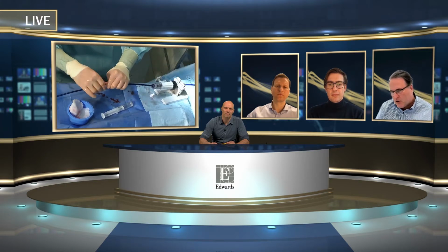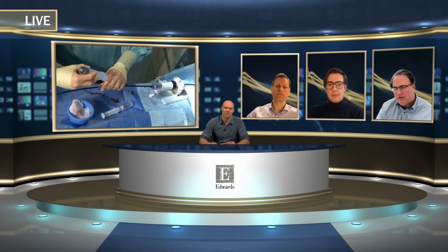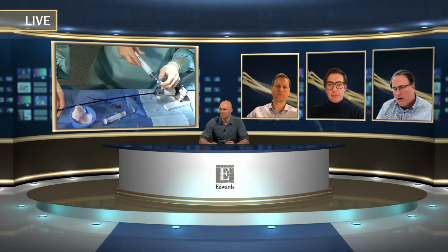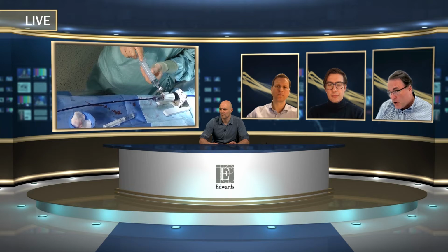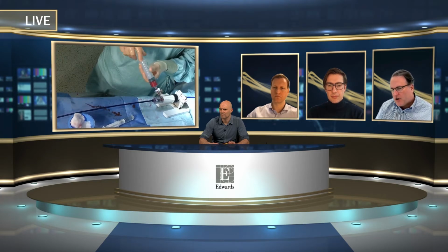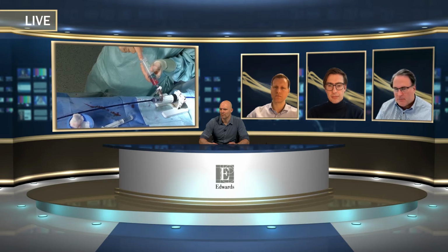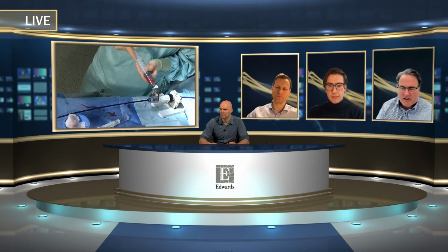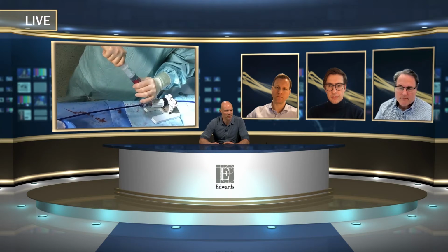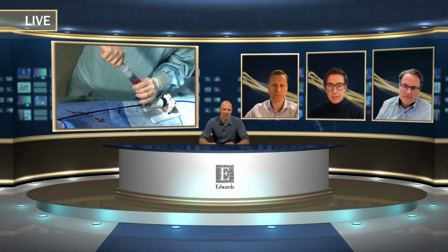So I would call this a secondary tricuspid regurgitation, definitely, and this is caused by myocardial impairment of perhaps both the mitral, the left ventricular, and somehow the right ventricular myocardium with the amyloidosis as a prime cause. How would the rest of the faculty see this? Yeah, Peter, what is your opinion? Because I had the impression that I saw quite some prolapsing and redundant tissue.